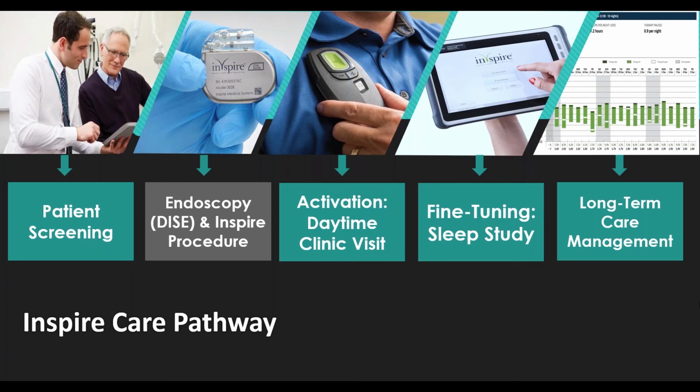Then at follow-up visits, we encourage them to get to a voltage that we think is going to work to control their level of apnea. Some people have very mild apnea, they're 15, 20 events an hour. Some people are more the 30 or 40. So we'll work with them until we know that clinically they're at least achieving good daytime functioning and their sleepiness is gone and that their nighttime snoring is gone. So once we've hit that threshold, then it's time to move into the sleep lab to confirm the optimal setting. And then just to encourage continued use.